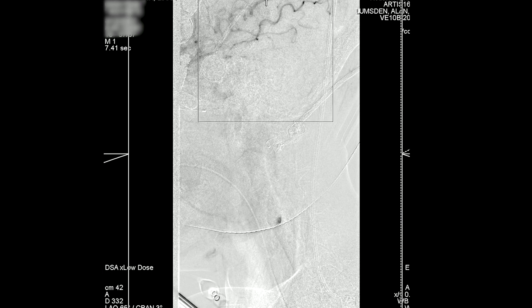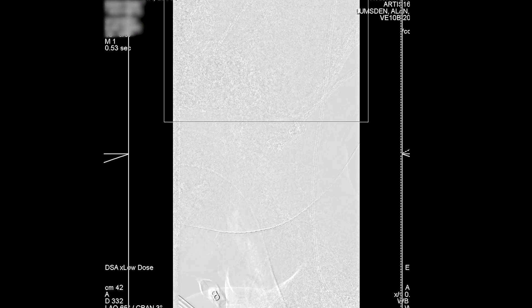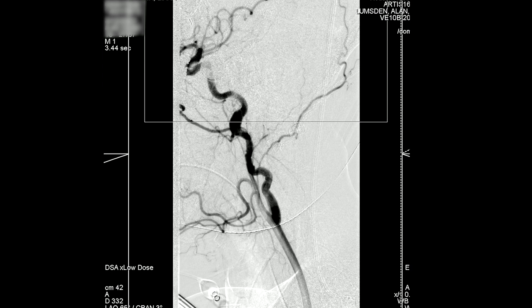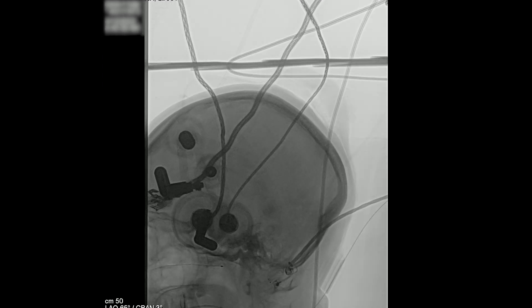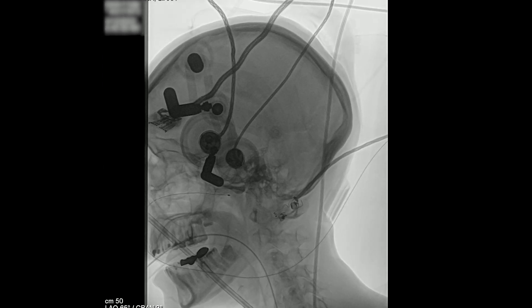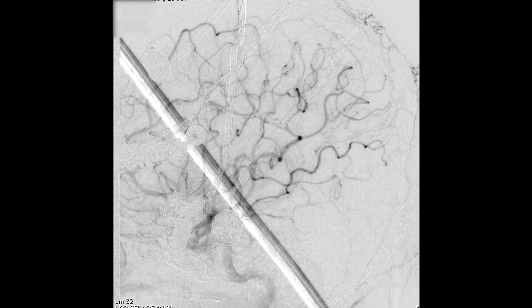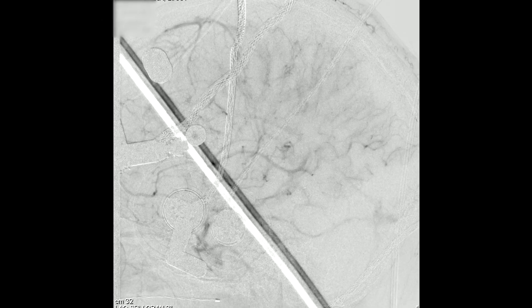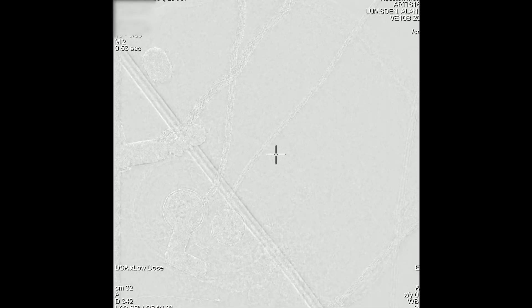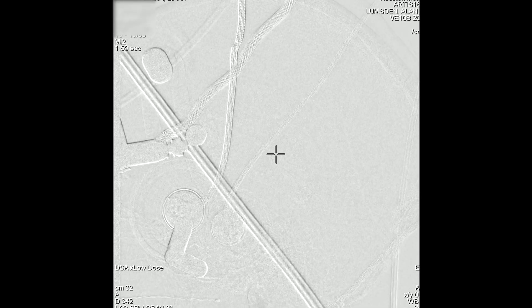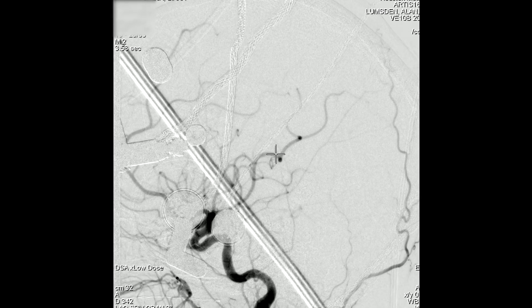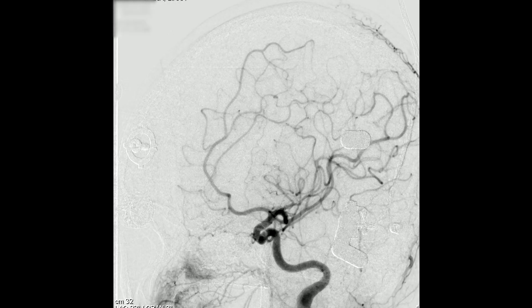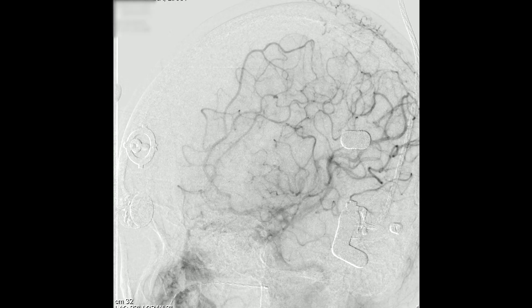There were no significant stenoses. We actually did not intervene in this patient. There's the lateral head shot with the middle cerebral artery coming towards us and the ACA going across the falx.